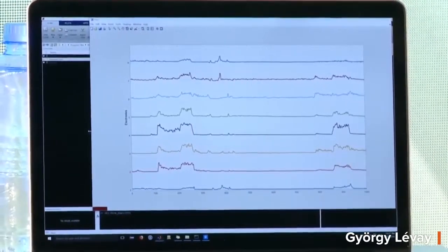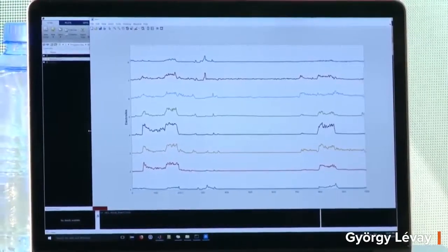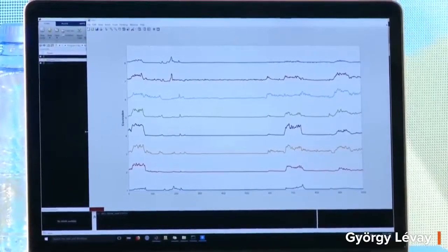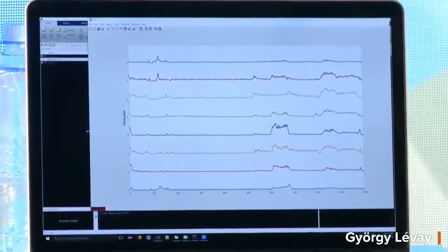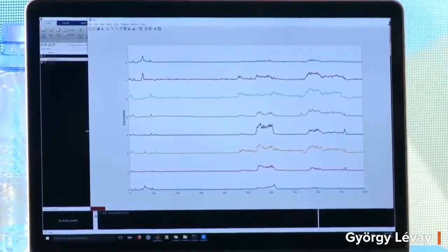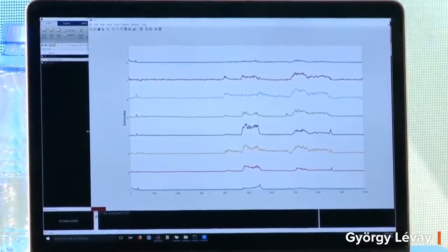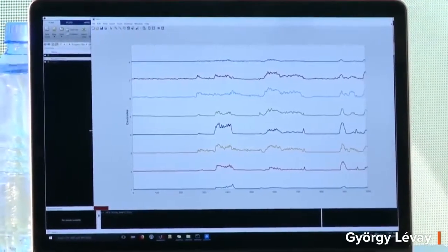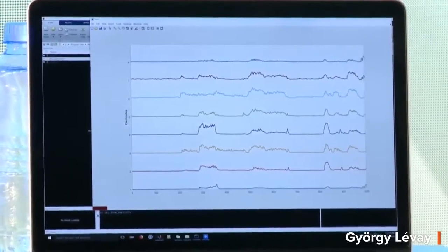open, just keep it open. You can flex your fingers outwards a bit. Yeah, there we go. So that's open. So you can rest now. And you see that there's a difference in the pattern. It's not really significant to the naked eye, but it's there. And so you can rest it again.